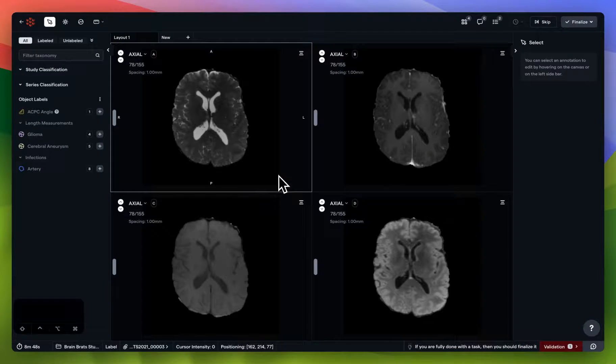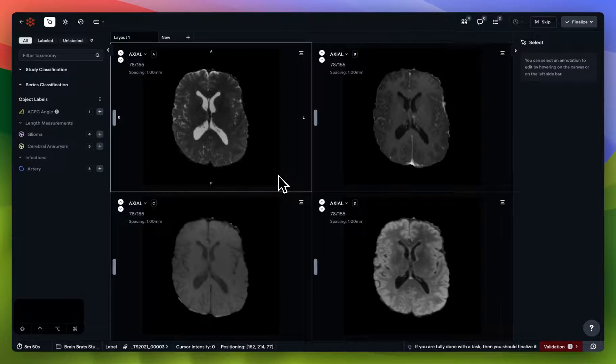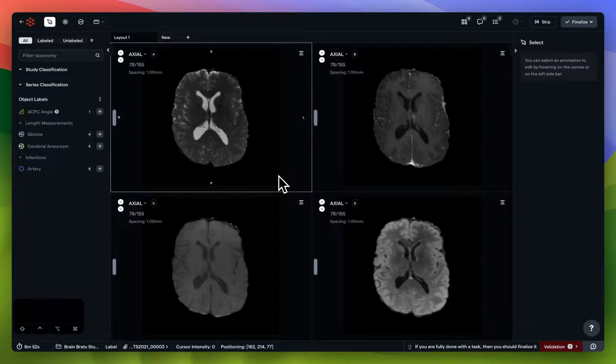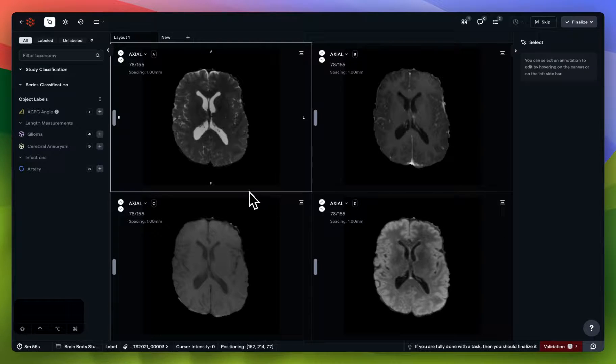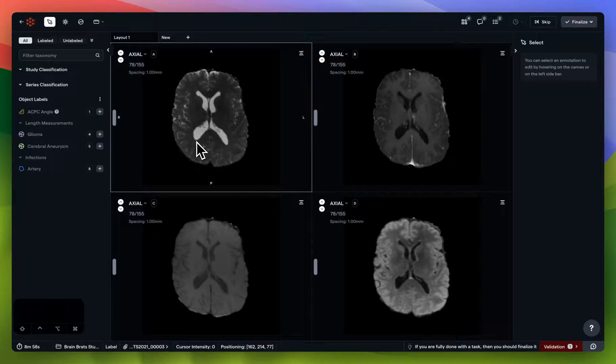Welcome to the Redbrick AI annotation tool. No matter what images or volumes you'll be working with in your project, you'll be greeted with the same four general zones the first time you open it and every subsequent time.